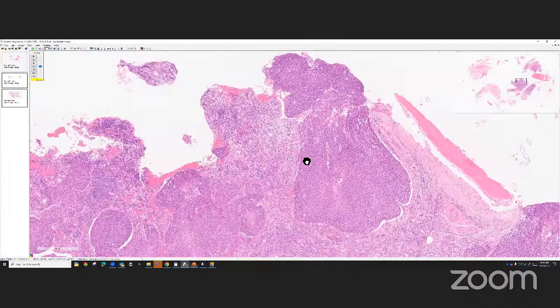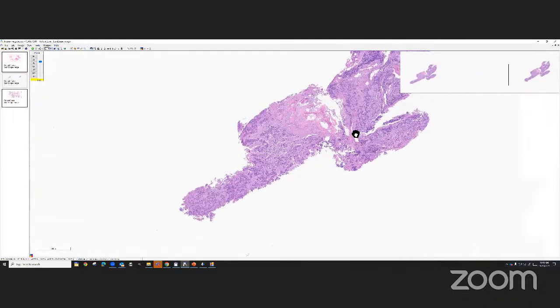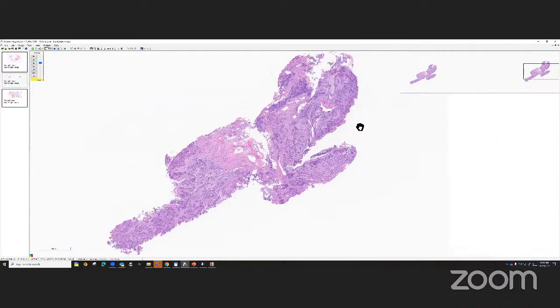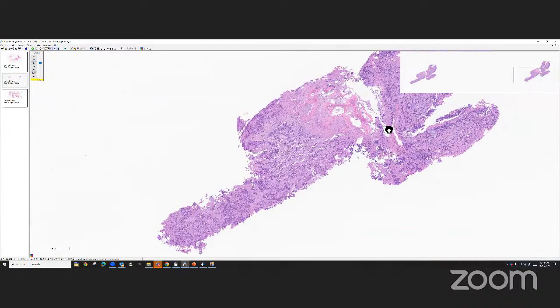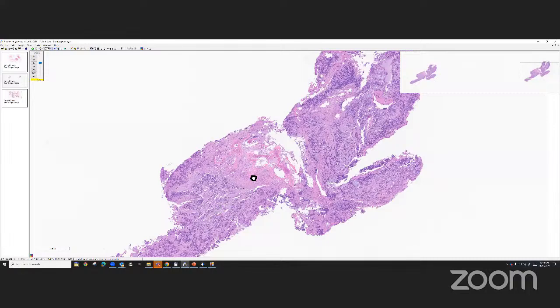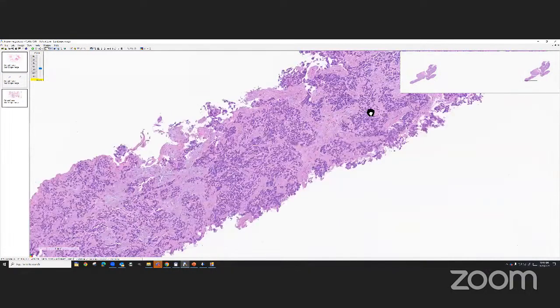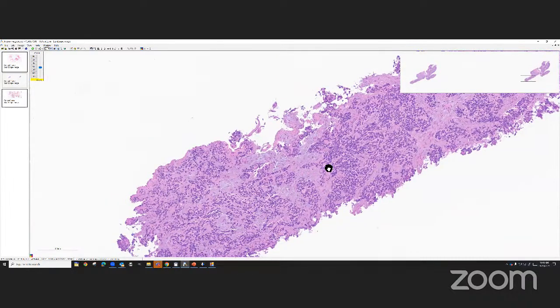you can see here we've got a much smaller biopsy specimen, okay? So just little pieces here, a little piece. And on first glance, you look at it and say, whoa, that's just a blue tumor. It's pretty nondescript. It's infiltrating in and around bone with some reactive bone formation. This does not look like it's going to give me very many clues. But if you look closely a little bit more, you'll notice that it's nested, but very loosely nested, not very tightly so. There's myxoid stroma in the background.